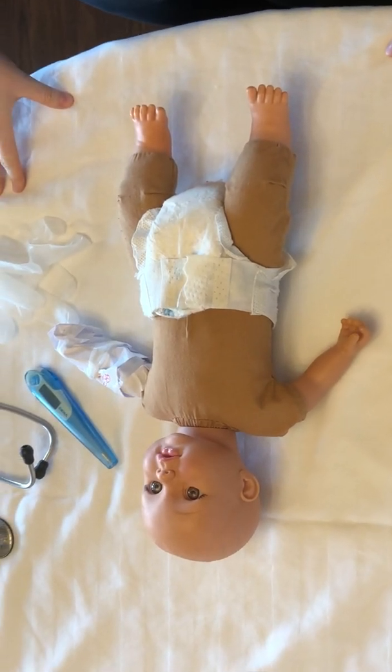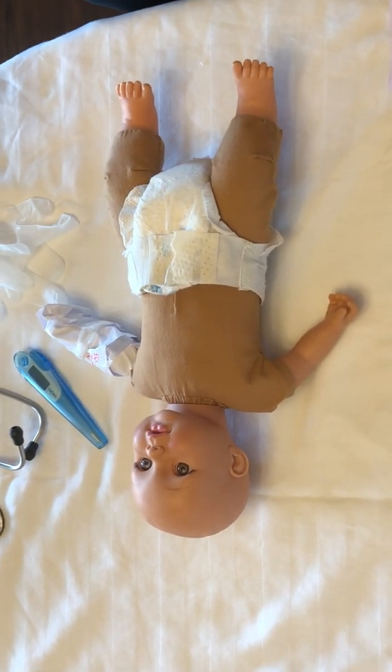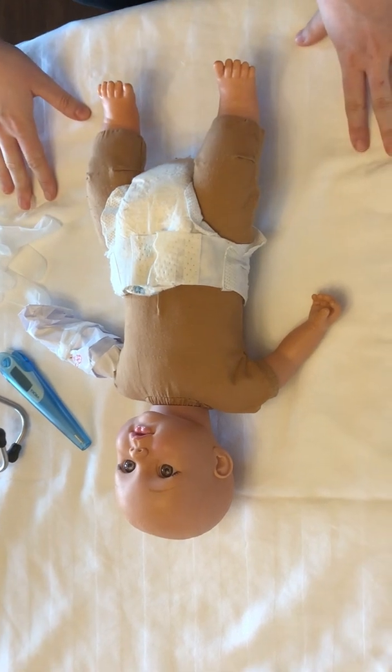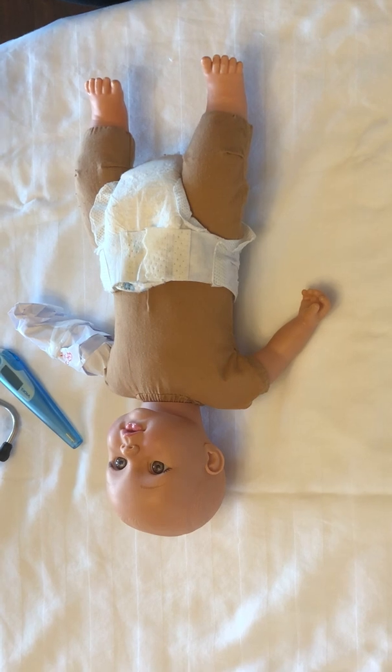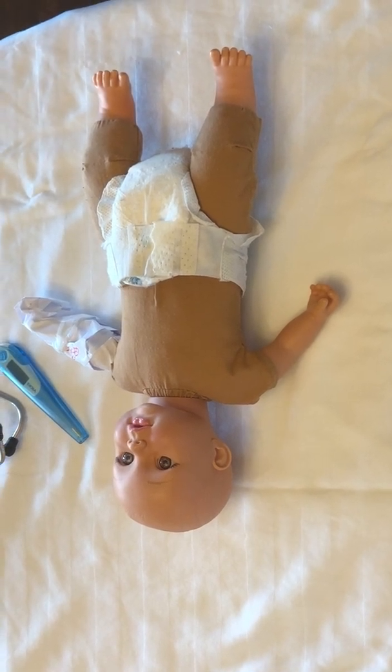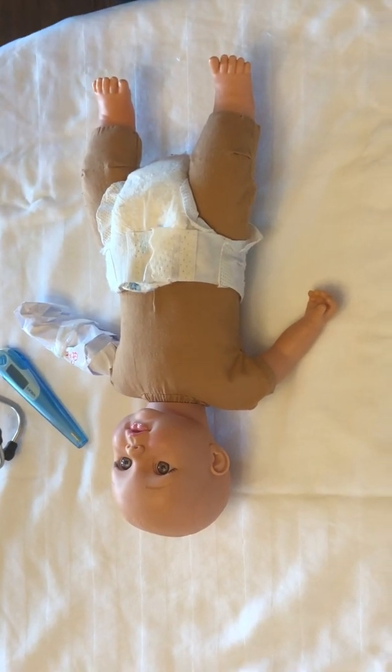All right, we're gonna start by making sure that all of our equipment is clean, and we're gonna bring the baby and set it down underneath a radiant heater so that it stays warm. We're gonna put on our gloves, and we're gonna start by taking the vital signs.